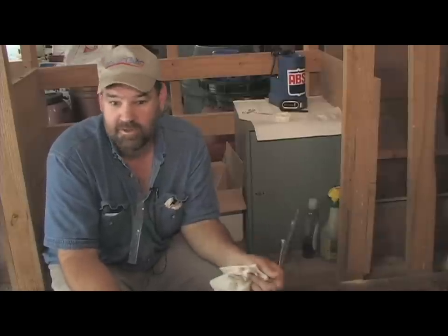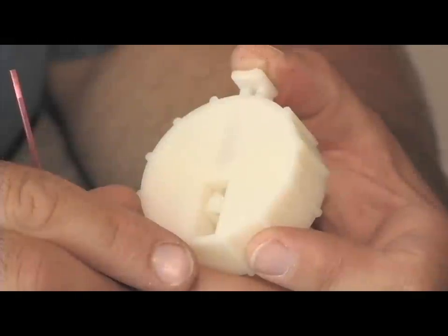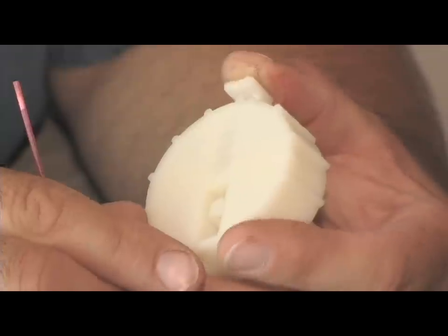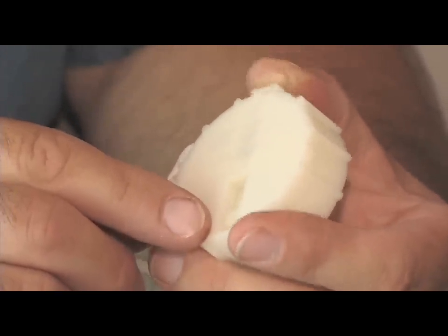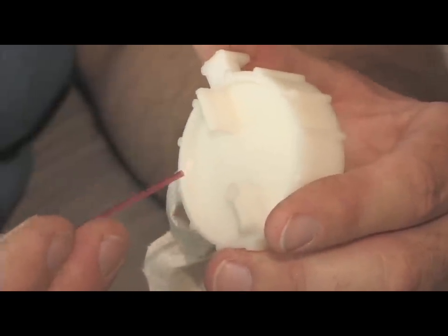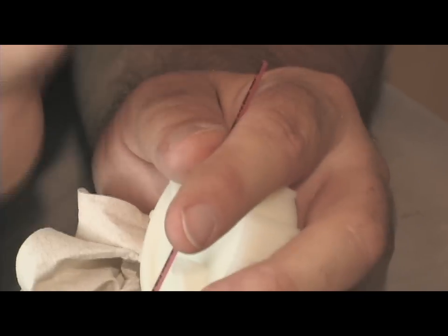Cycles are the same, temperature is the same — they're very similar. Now this is the cutter. I wash this with alcohol every time I use it. It's just an idiot-proof way to cut the straws off when you're in a hurry and a little nervous and stressed. It's worth the two bucks or whatever it is. It's just a blade that slides along on a spring, cut at an angle. What you do is turn it around, stick it in the hole like so, and mash the thing and it just cuts it for you right there. Be sure you cut the right end — the one end's got the corks, the other end's mashed flat. Cut off the mashed flat end and leave the corks.